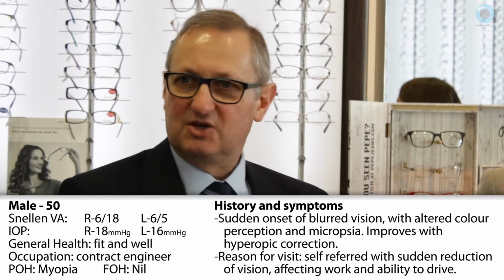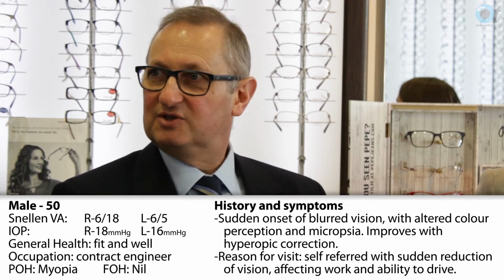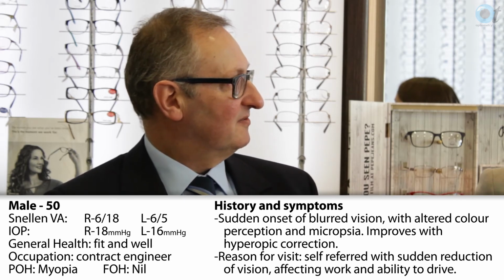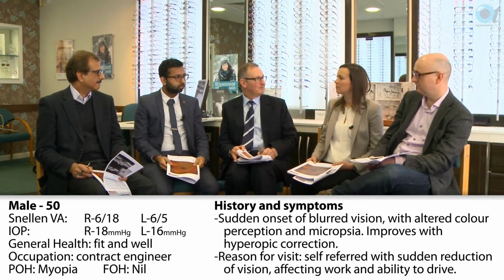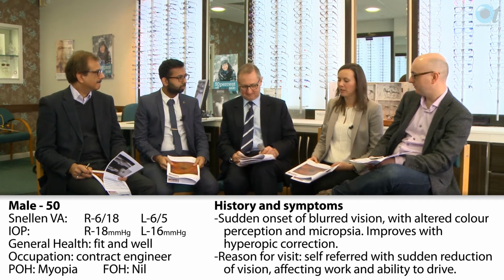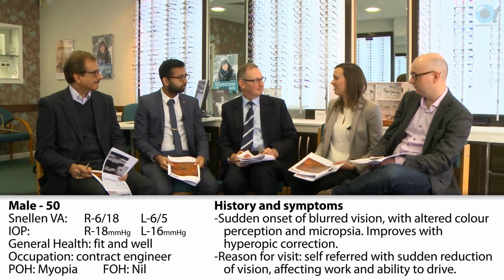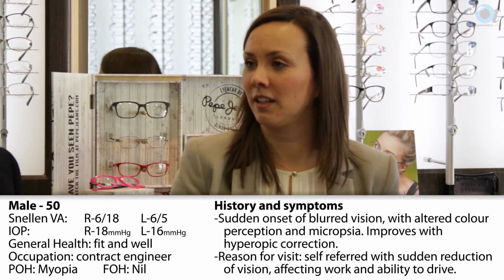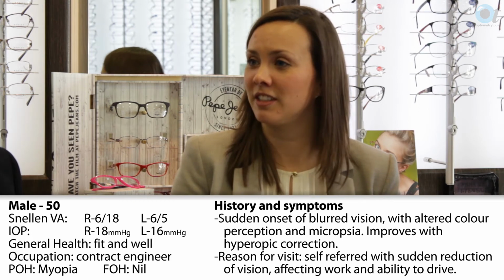And what are the implications for us as optometrists in practice, where you've got a patient who's unhappy with their vision? Do you think the patient could come back in between time dissatisfied, asking for your help? And in which case, what do you think you might do? Well, I've had people who are interested from their own point of view to see how something's getting on, and actually they might come back and say, well, can you do it again, and we can compare and see if it's getting any better. And sometimes it's quite useful, if they think it's getting better, to OCT them again and say, yeah, just reassures people a little bit.